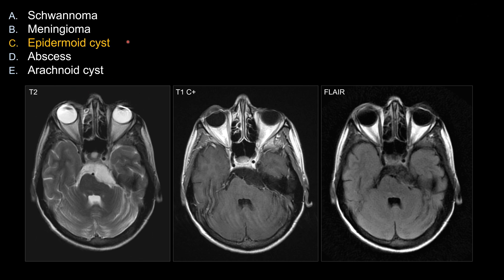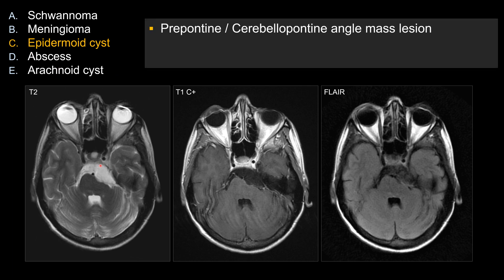The correct diagnosis is epidermal cysts. Let's look at some imaging features that make epidermal cysts the best choice among the five possibilities. You can see expansion of the prepontine cistern as well as the CPA cerebellopontine angle cistern, with mass effect against the brainstem as seen here. On T2, it's extremely bright, just like CSF. On T1 post-contrast, it does not enhance, just like CSF.